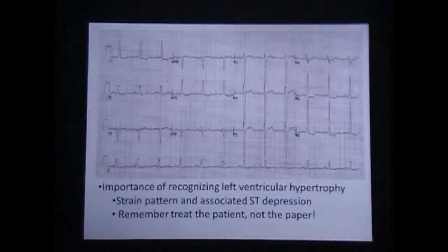Well, the only reason I have the question is, for our criteria, we would not typically activate the Cath lab for elevation in the presence of LVH, is the kind of black and white answer to that question. But maybe the answer is to recognize what the pattern normally looks like for LVH, and then if we're seeing something that's different from that, maybe we would forward that EKG to the hospital and have them make that determination. I agree with that. And even the cardiologists complain about the ER docs and how they're reading the EKG. Yeah, and everyone has their own way they're going to read it. It is, but transmitting and giving a picture, and they're like, yeah, then you're good.